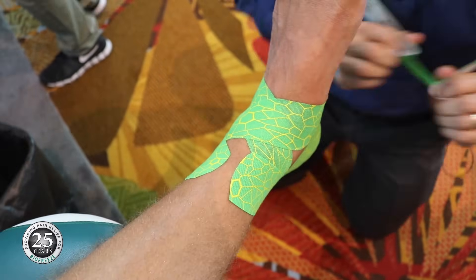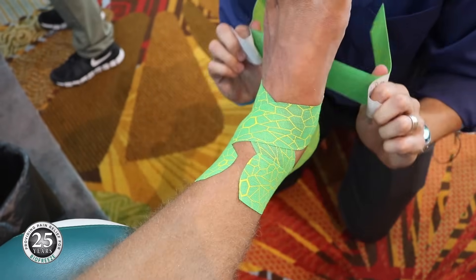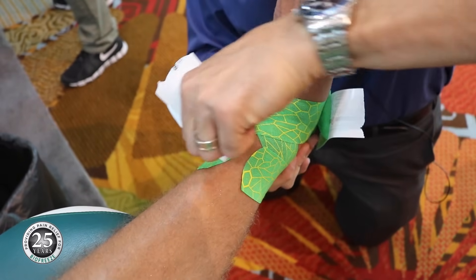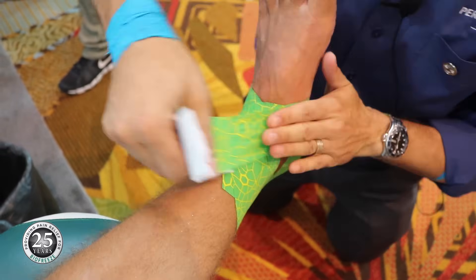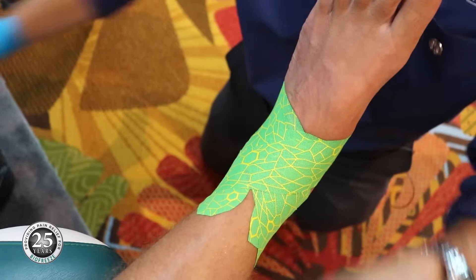The next one is a second strip over the ankle mortise, giving that 100% stretch. As you can see, I'm going a little bit more superior now, covering up the ankle just a little bit more each time.